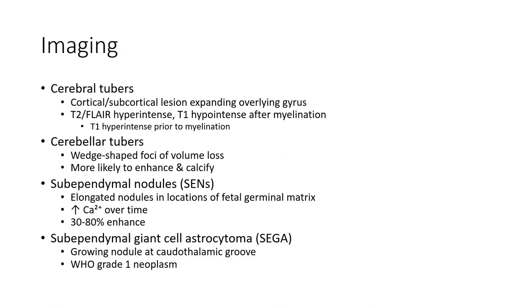Imaging of cerebral tubers: These are located in the cortical and subcortical region, expanding the overlying gyrus. On MRI they are T2/FLAIR hyperintense. They are T1 hyperintense after myelination and T1 hypointense prior to myelination.